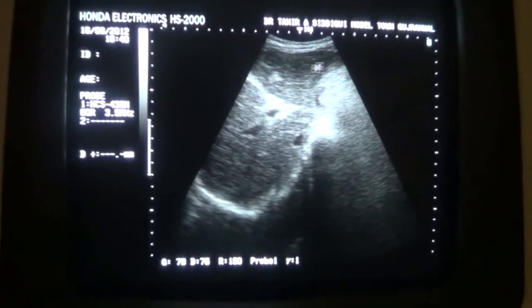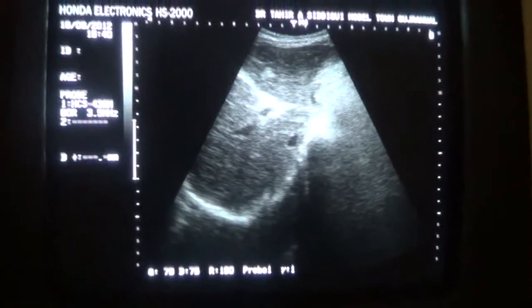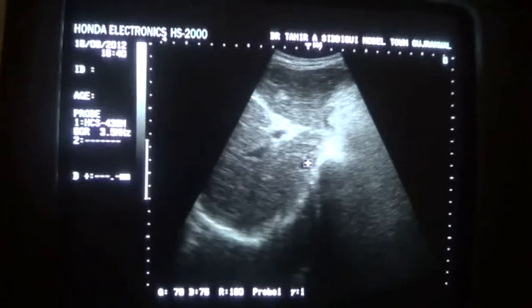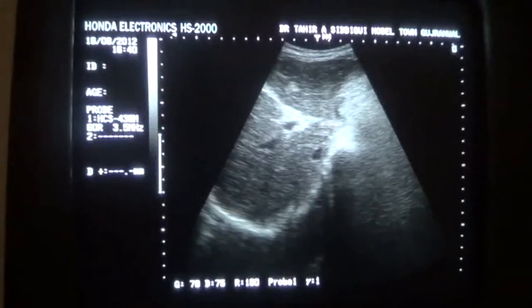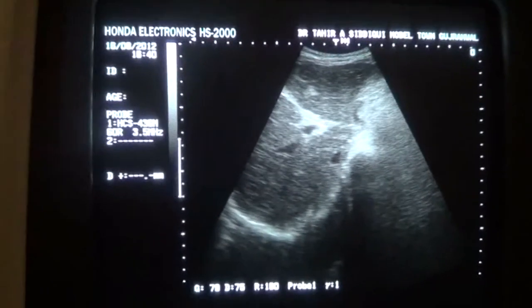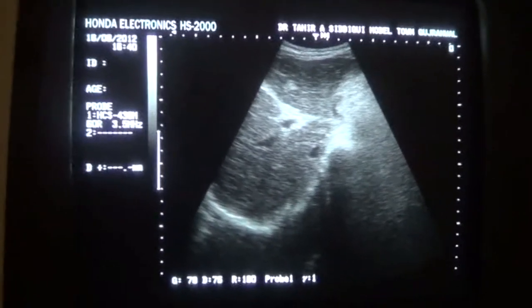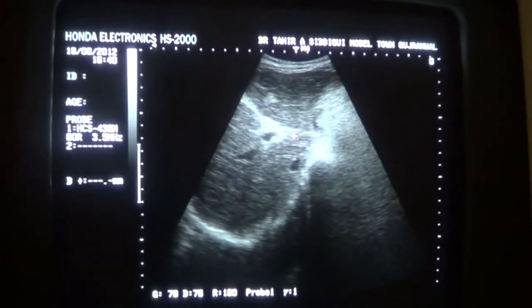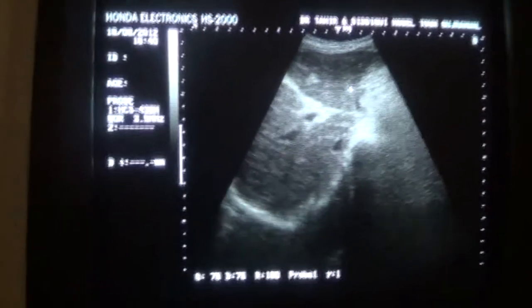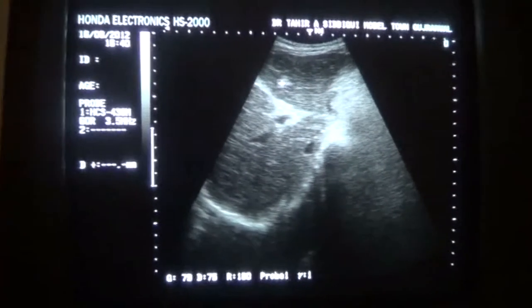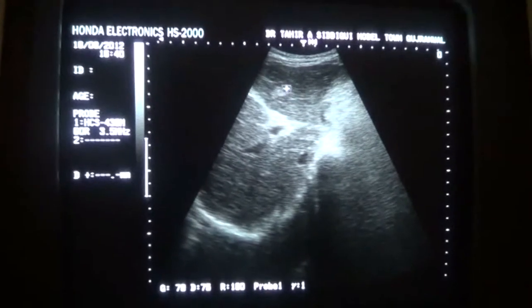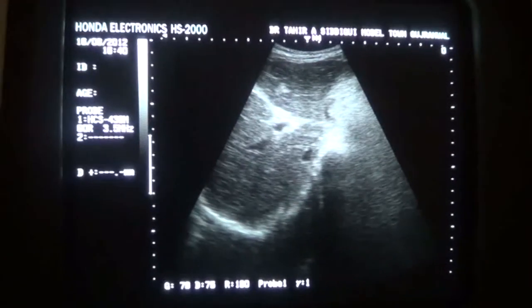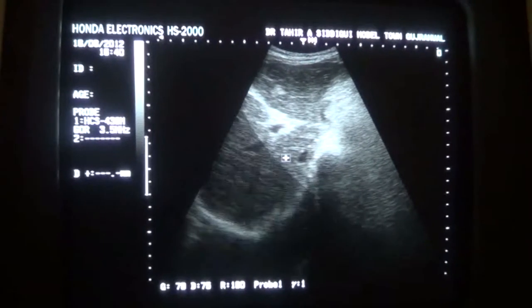This is the left lobe of the liver, this is the right lobe of the liver, this is the ligamentum venosum, and this is the IVC. The portion between the ligamentum venosum and the IVC is segment one of the right lobe of the liver. This is the central section of the left lobe of the liver; in this you are seeing an echogenic area — an evenly echogenic area with no posterior wall, no posterior shadowing.